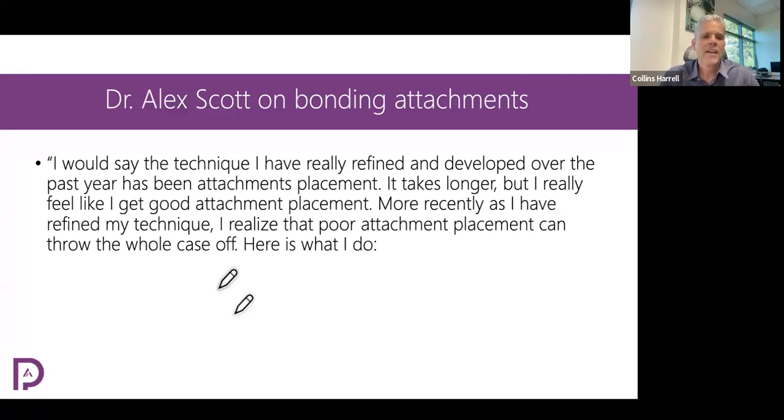So he said, I would say the technique I've really refined and developed over the past year has been attachment placement. He said it takes longer, the technique he's using, but I really feel like I get good attachment placement. More recently, as I've refined my technique, I realized that poor attachment placement can throw the whole case off.